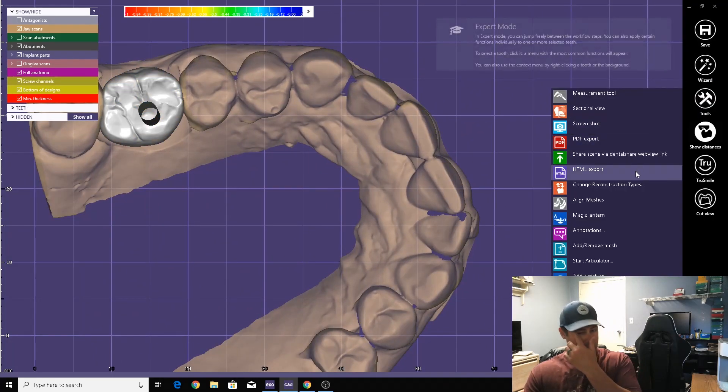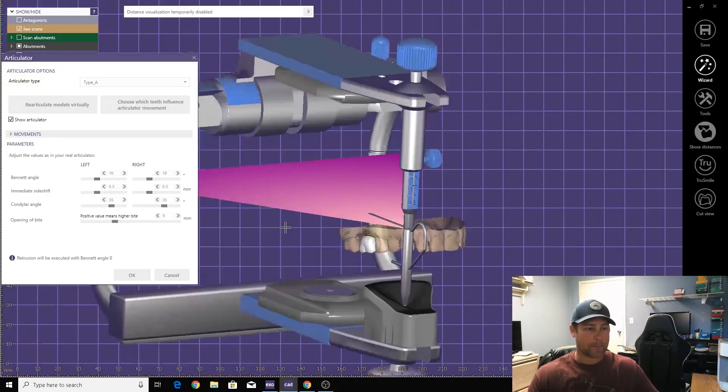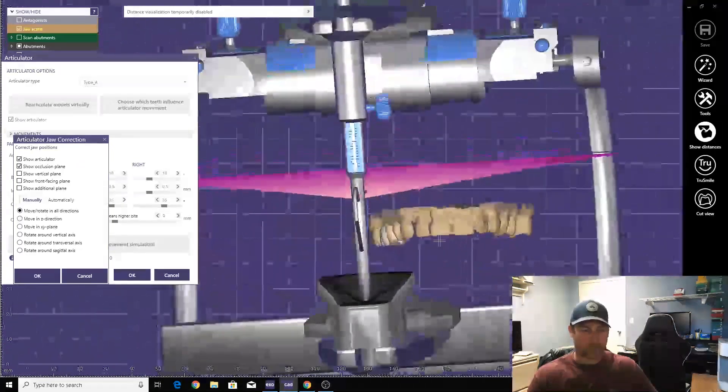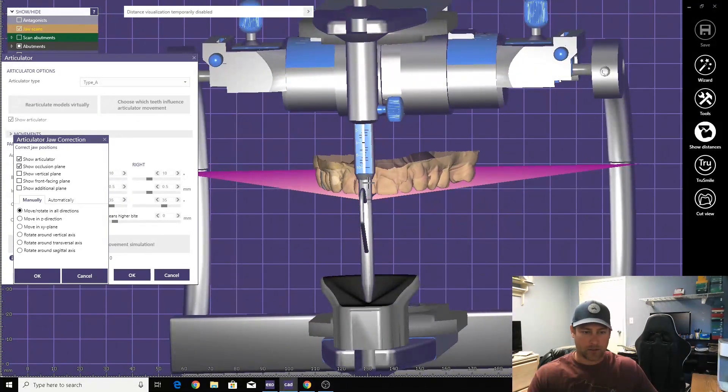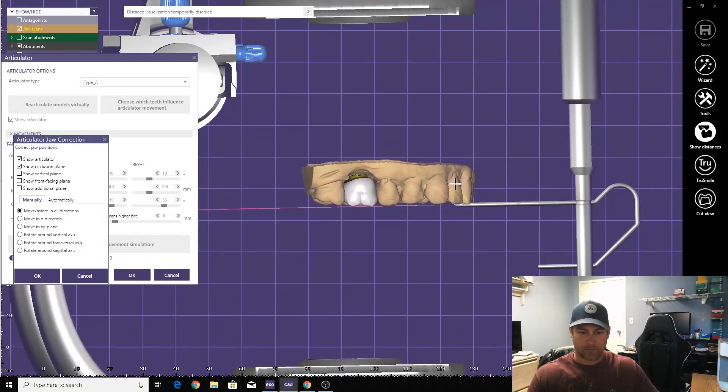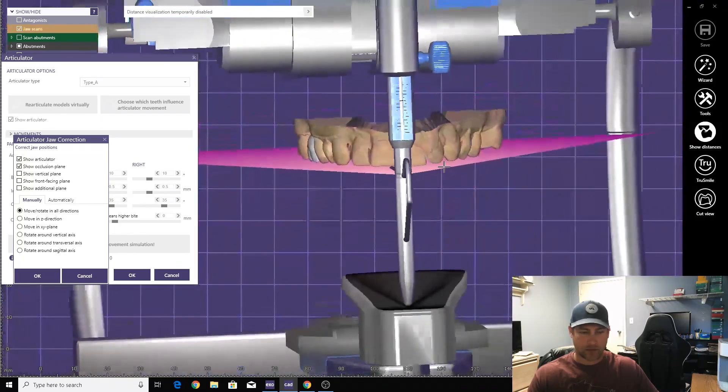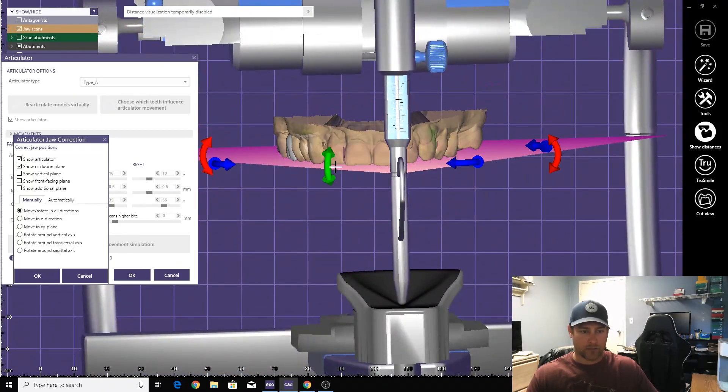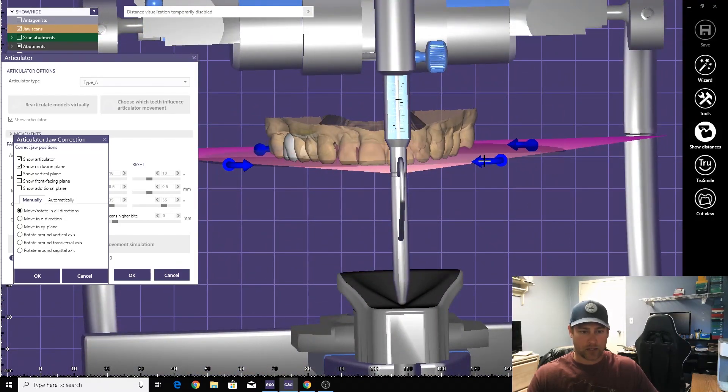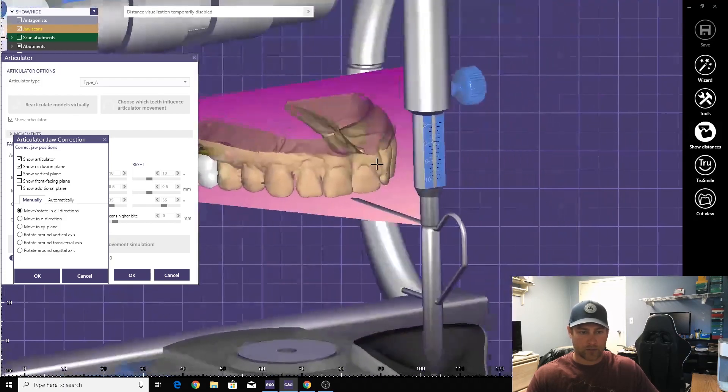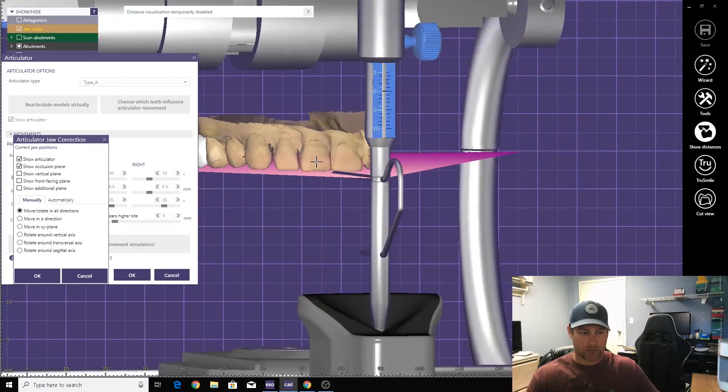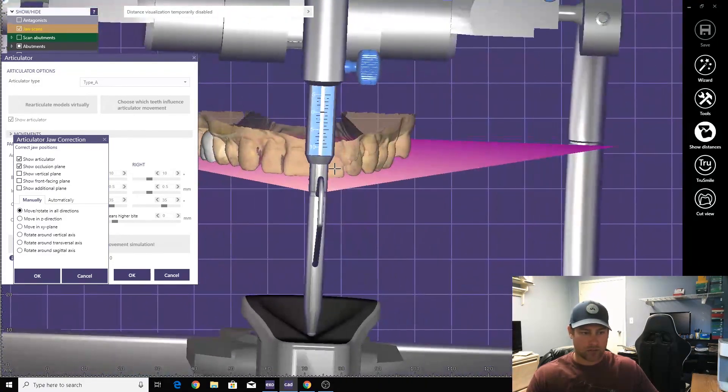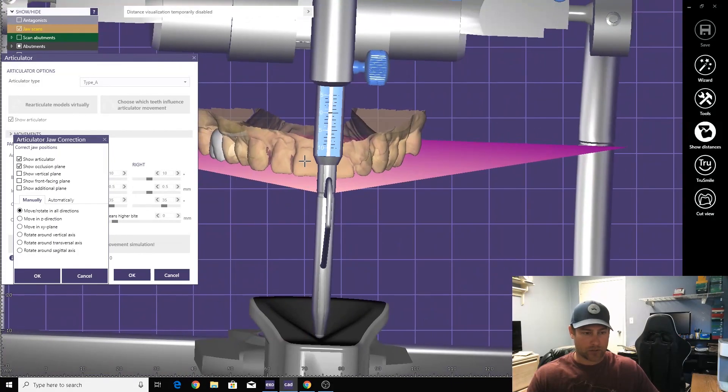All right, cut occlusion. Go to articulator. Line it up on the point. Again, if you guys don't have a 3D mouse, highly, highly recommend it. It'll speed up processing, not burn you out so much.